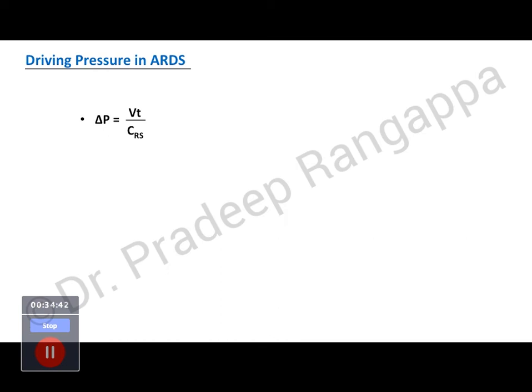Okay, so I think the most recent concept that we have learned in intensive care about plateau pressure and PEEP is combining both. So what you learned now, low tidal volume is the way to go, high PEEP is the way to go, in moderate to severe ARDS. But what we have newly understood, just around 2 to 3 years back, this landmark article came in NEJM. We have understood a concept called driving pressure. So driving pressure is combining your plateau pressure and PEEP. Driving pressure is nothing but the tidal volume titrated to the compliance of the respiratory system.